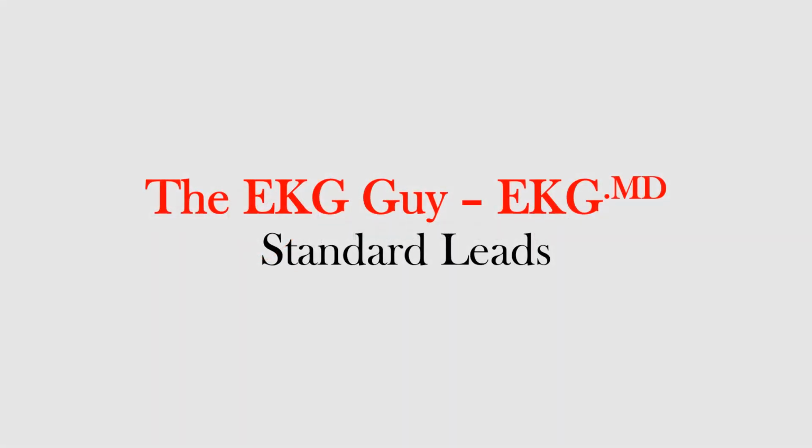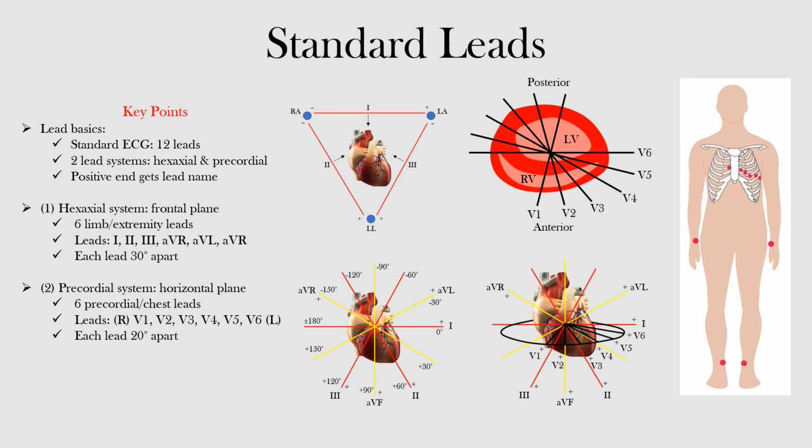In this lecture, we will discuss the leads, specifically the two lead systems and how they combine to give us the standard 12 leads on the EKG. There are 12 leads that make up the standard EKG, and it is composed of two lead systems that we will discuss, the hexaxial system and the precordial system. The hexaxial system is made up of 6 limb or extremity leads, and the precordial system is made up of 6 precordial or chest leads.